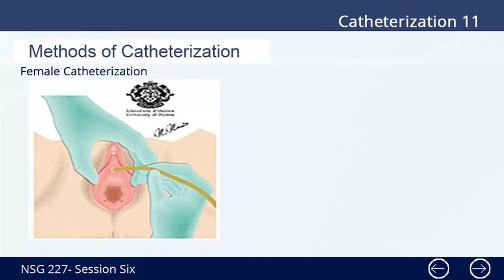12. The drape with its center is placed over the perineal area, exposing the labia. The drape expands the sterile field and protects against contamination. It is optional. 13. Place the sterile tray between the client's thighs. This provides easy access to supplies.